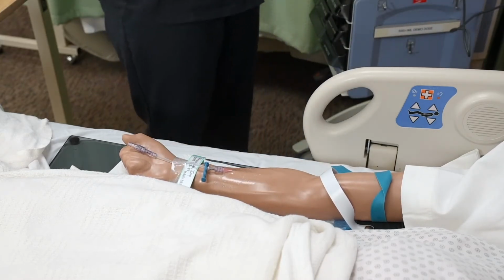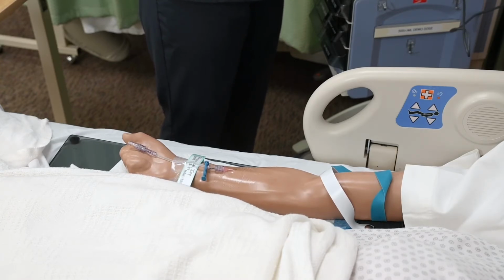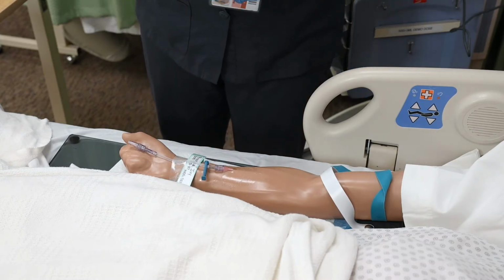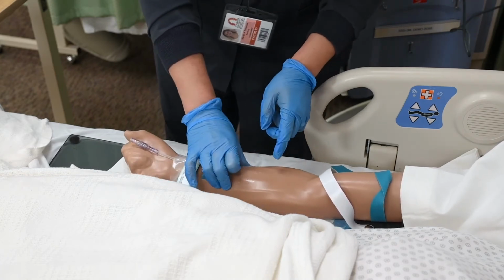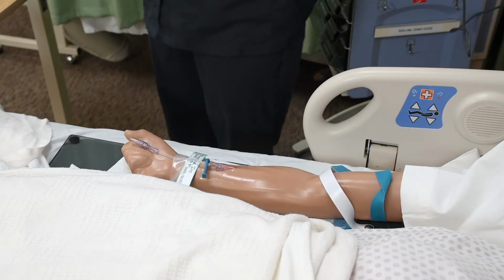Label the IV dressing in accordance to agency policy. Include the date, time, gauge, and length of needle and your initials. If not administering IV solution, apply a swab cap.